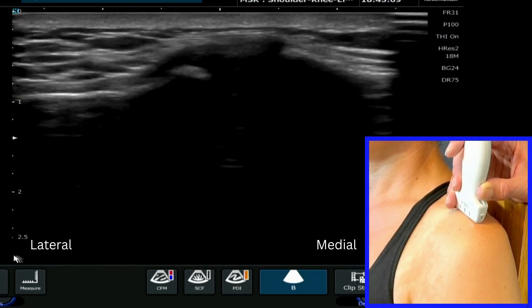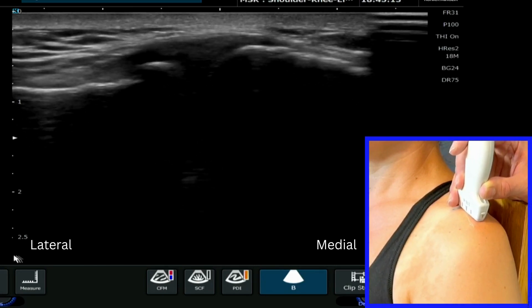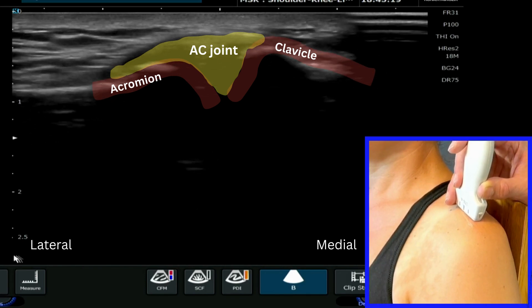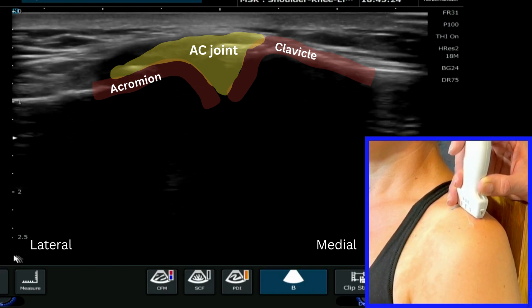If you keep moving your probe across towards the clavicle, you'll eventually come across the AC joint, which you can see very clearly here. You can utilise the little finger just to stabilise your probe and make sure you don't slip off this joint.